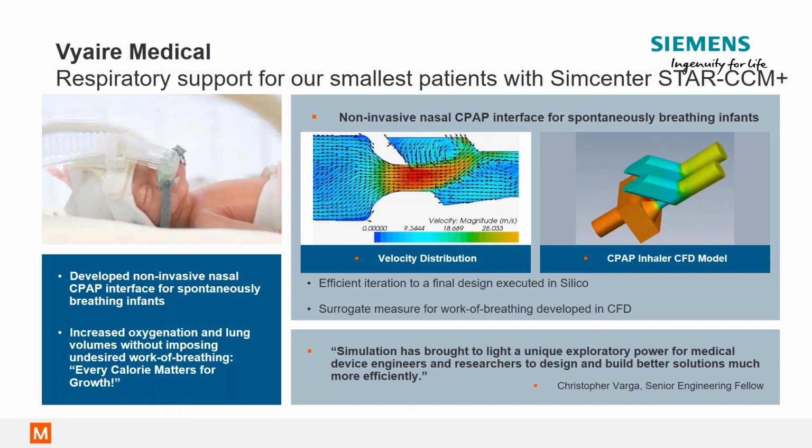But once they had their model ready, they were able to improve it so that when the infant is breathing, the jet flow is directed towards their nostril. And if they demand more flow with their breath than what the system can provide, the jet will actually entrain flow from an entrainment port. And as soon as they take a breath out, the jet would be moved out of the way. And that really helped them to breathe without doing a lot of effort, which is really important for a premature infant.